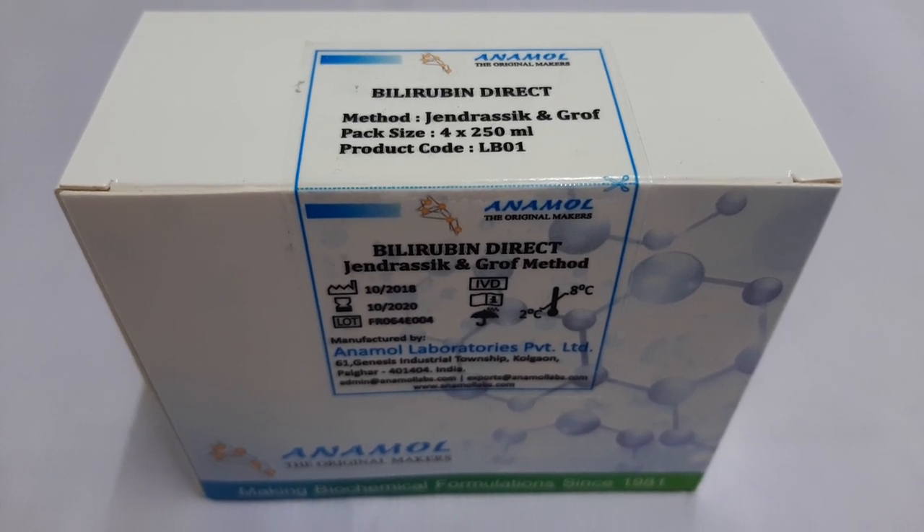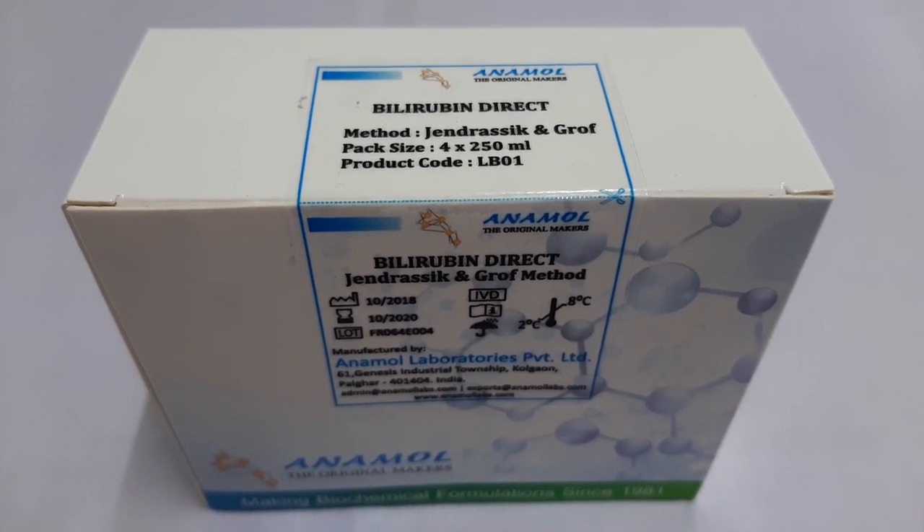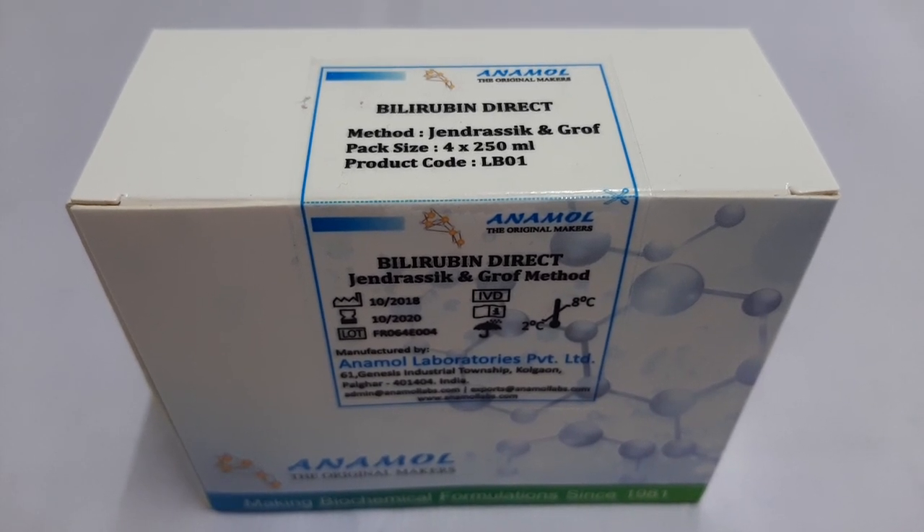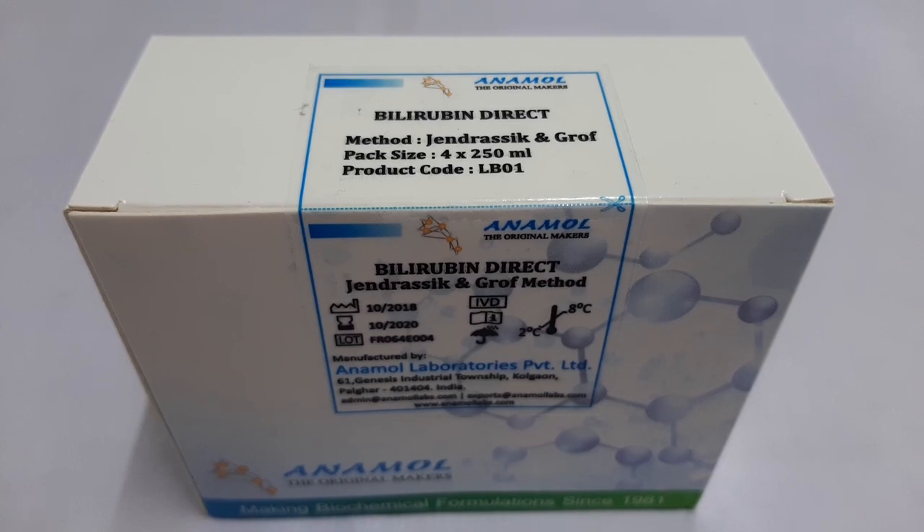Hello everyone. In this video tutorial, we will see how to perform bilirubin direct test using the kit manufactured by Anamo Laboratories Pvt Ltd.